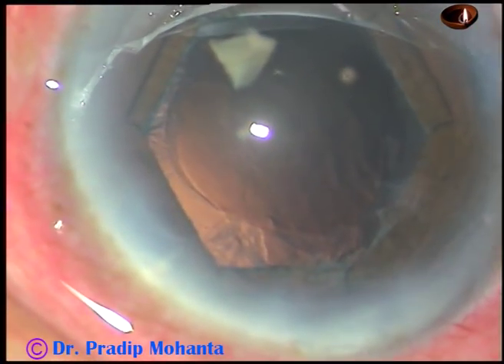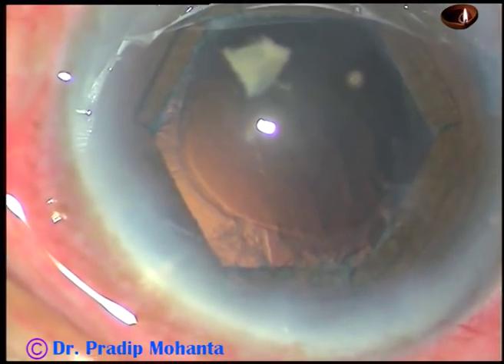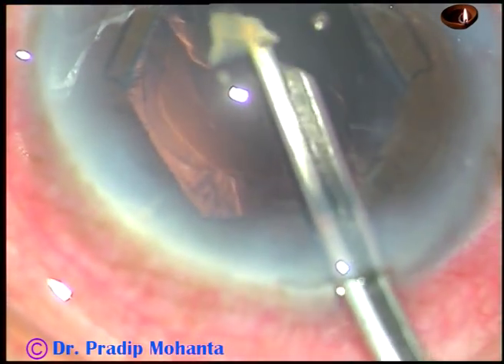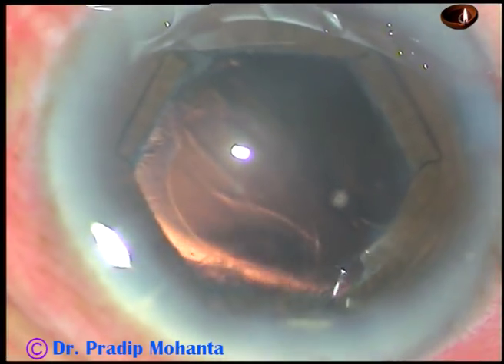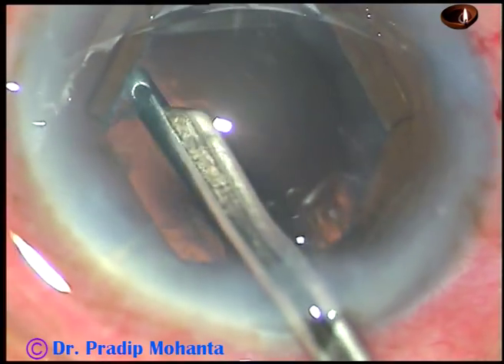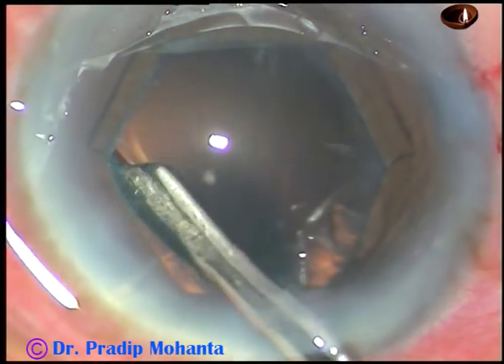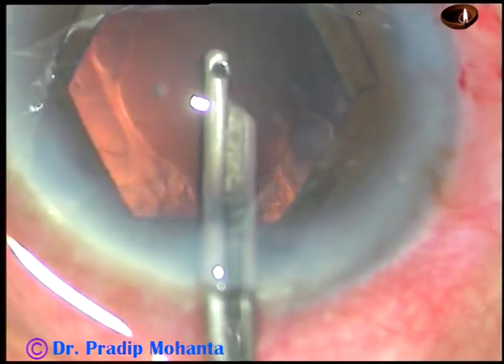If you see a small nuclear piece, remove it first — otherwise it can get lost somewhere under the iris and you may find it difficult to locate it later. I introduce the Simcoe cannula, go near this nuclear piece and scoot it out. As I try to remove the cortical matter, I found zonular weakness between 4 o'clock to 7 o'clock, and there was a small zonular dialysis at around 5:30 o'clock.